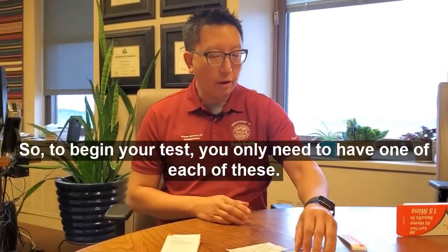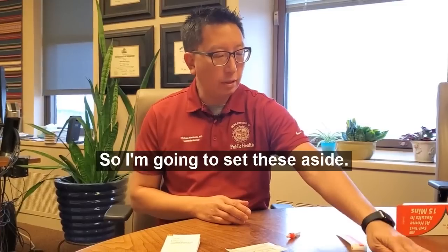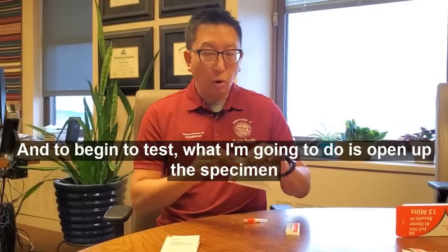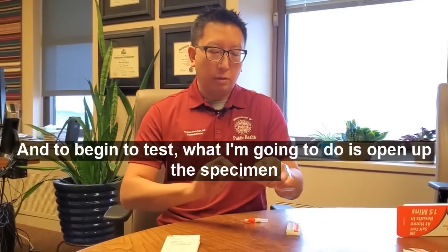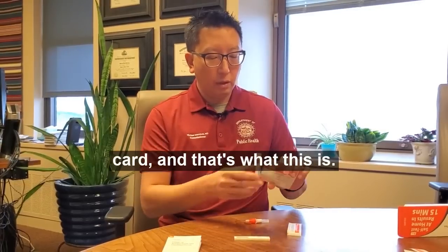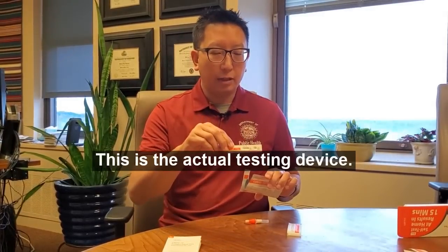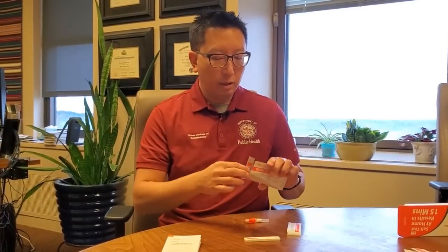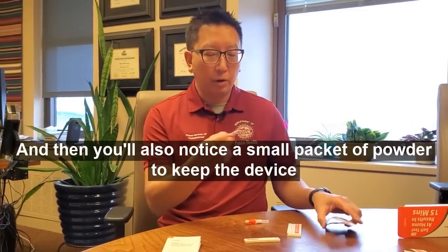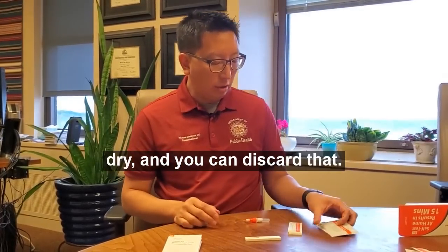To begin your test, you only need to have one of each of these, so I'm going to set these aside. To begin, open up the specimen collection card — this is the actual testing device. You'll also notice a small packet of powder to keep the device dry, and you can discard that.